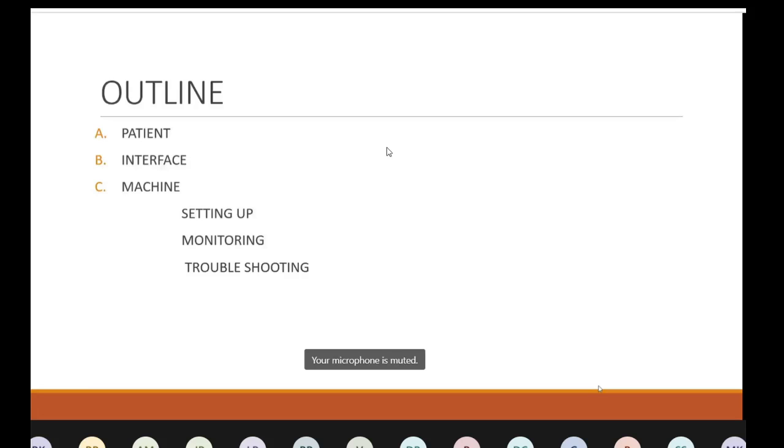And when you have 5 or 6 NIVs, all of them are leaking through their masks or other areas. There is a significant leak in the system, and this can cause pressure drops. So that is why leaks are very important. You have to troubleshoot the leak by taking time for every patient. Okay, so what type of mask should you use for this patient?